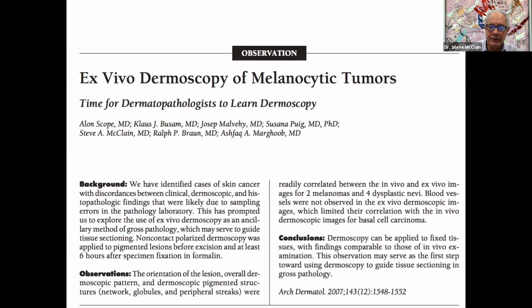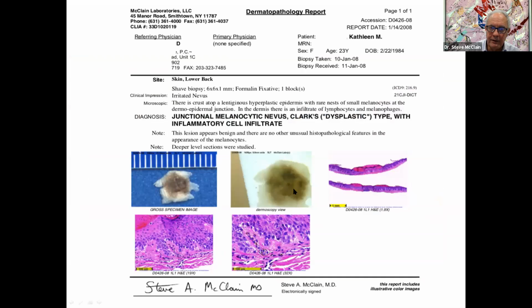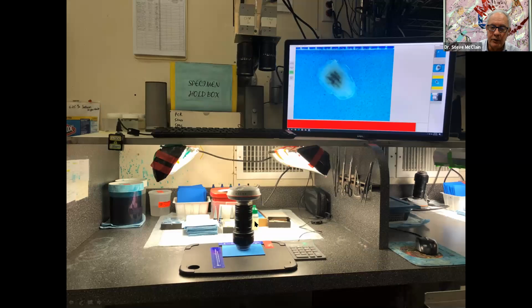I'm going to skip over this one, but I've been working in dermoscopy for quite a while, and we actually installed them in the lab. This is the original one we used in the lab, and we've been doing this since 2008. But the dermatoscope works by allowing you to see down into the tissue, so you get a clearer view of what a potential skin cancer is. This is our newer model dermatoscope, and this is the image of a nevus on the sole.